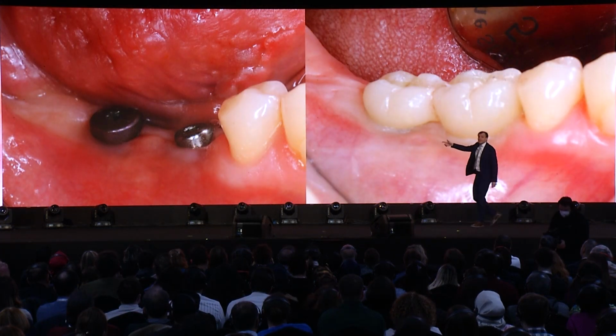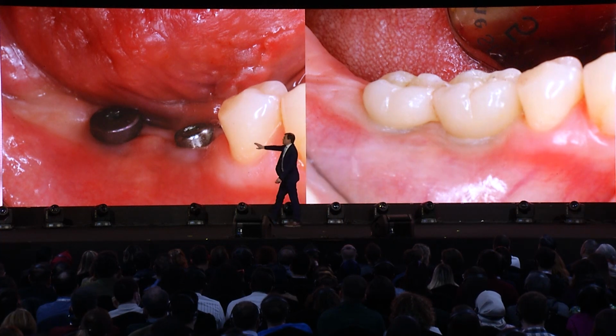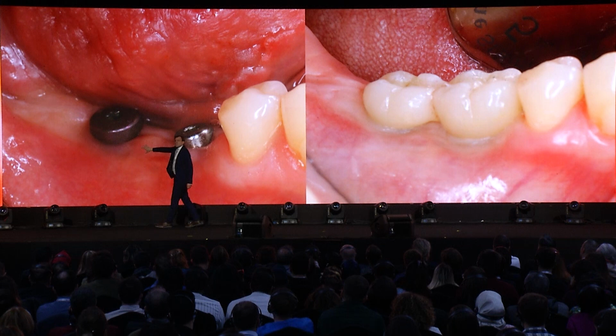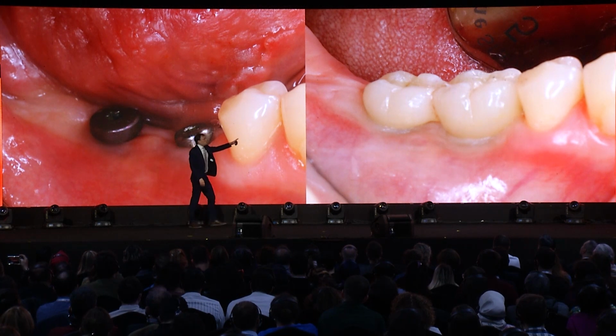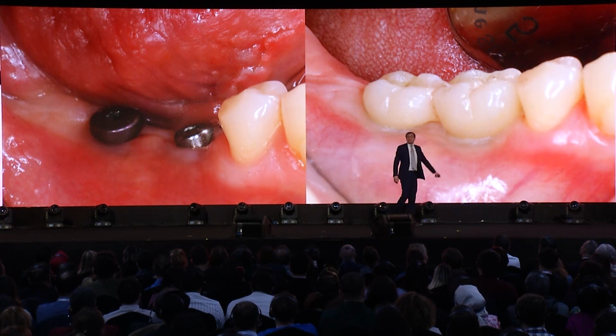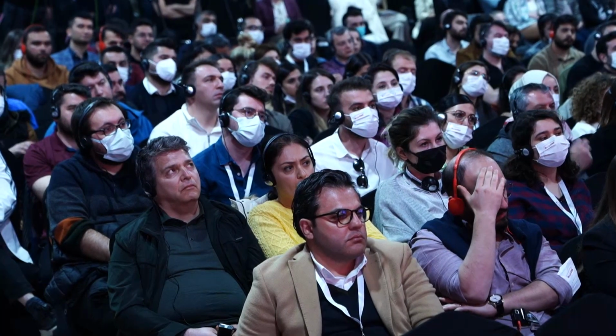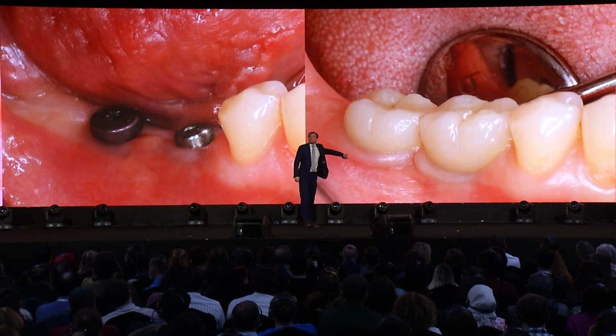Now, this case, I like this the most. 2 implants. Here we definitely need keratinized tissues. So sometimes I do like this: first of all, we make the restoration, and then I know the exact position of the margin, and afterwards I'm making keratinized tissues. But once we made the restoration, the patient did not come for this procedure. The patient came after half a year, like this.